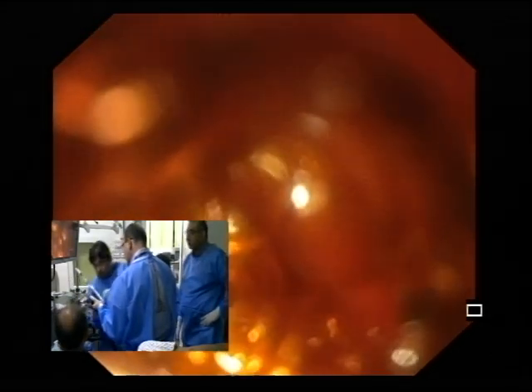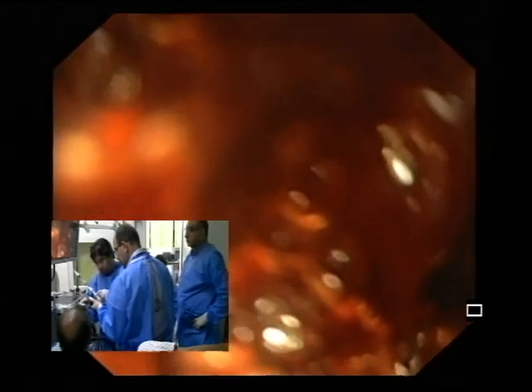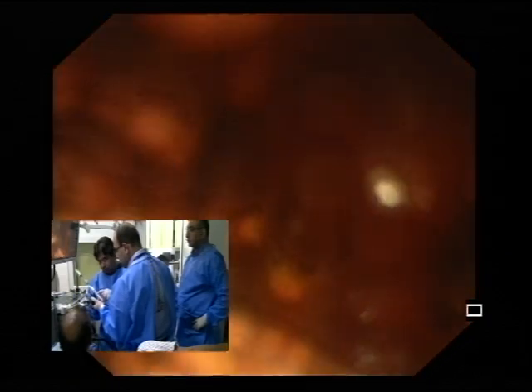Yes, please. The Boston Scientific dials are not the best quality dials because they fall off like I just did. But you'll find it. Thank you. But all FNA needles are pretty much equivalent, so it doesn't really matter which one you use.